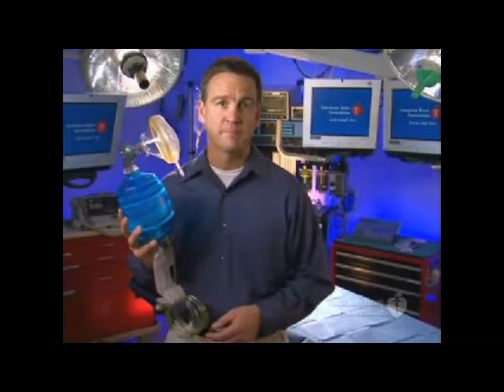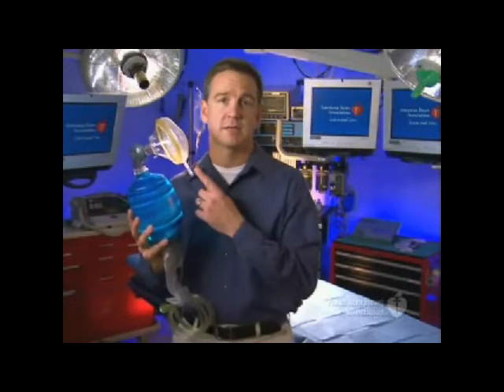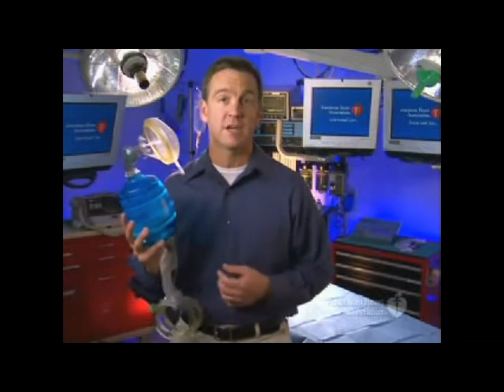Sometimes rescuers will only give breaths without chest compressions. This is called rescue breathing. Ventilation is more effective when providing rescue breathing for an unresponsive, non-breathing victim when you use a bag mask system. A bag mask device consists of a ventilation bag and a face mask. The bag may or may not contain a valve to prevent rebreathing of exhaled air.